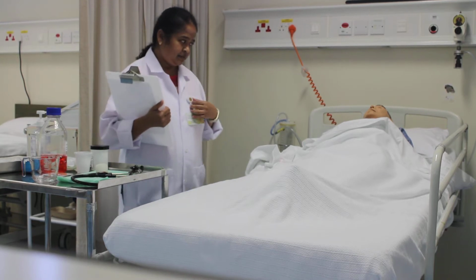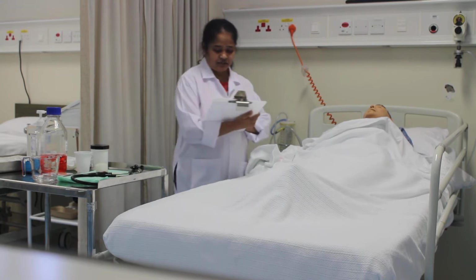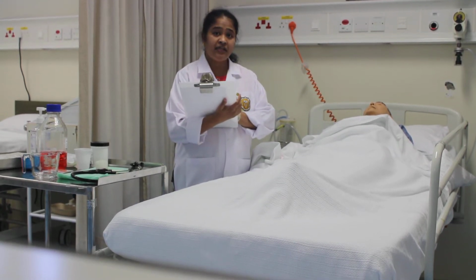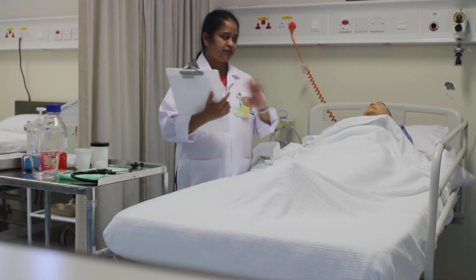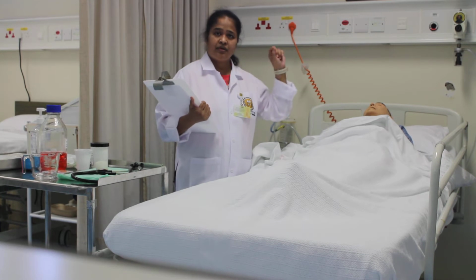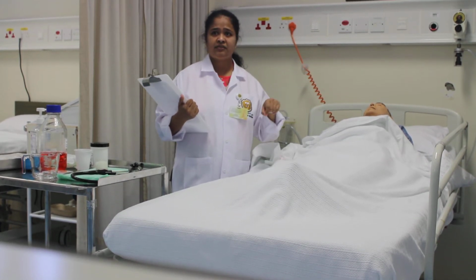Okay. So as we all know, in the regular procedure, first you check for the doctor's order. The doctor's order says we need to start feeding for this patient, NG tube feeding. This patient has got some swallowing difficulty, dysphagia. So we are going to insert a tube through the nose into his stomach so that we can use it for feeding.